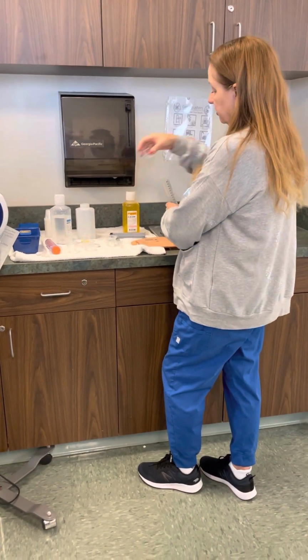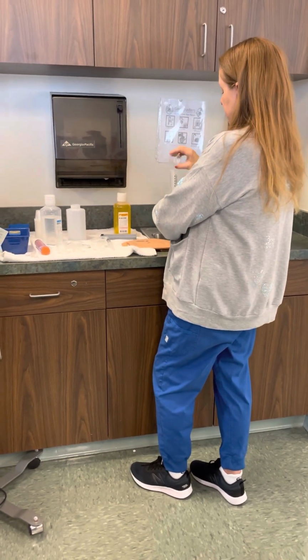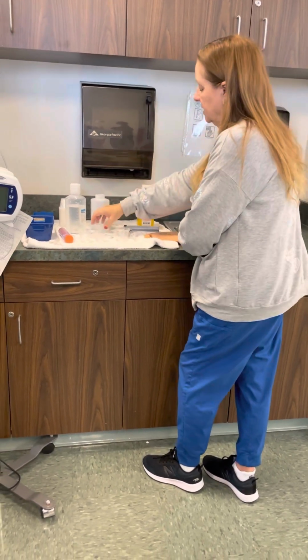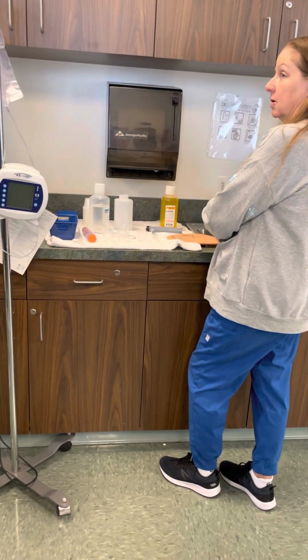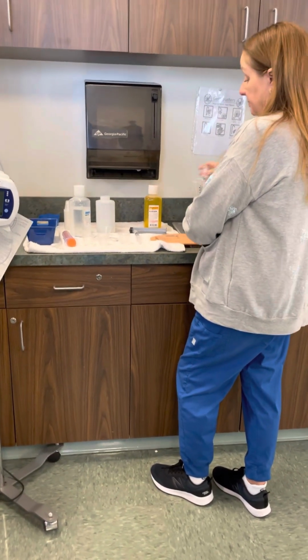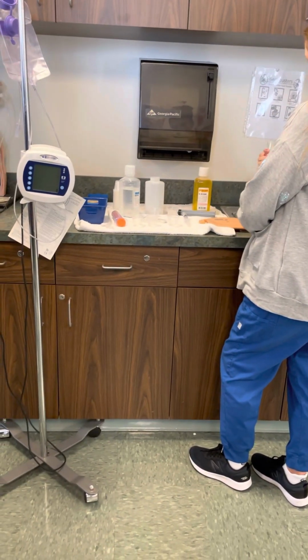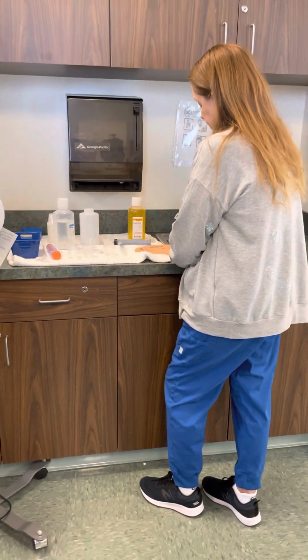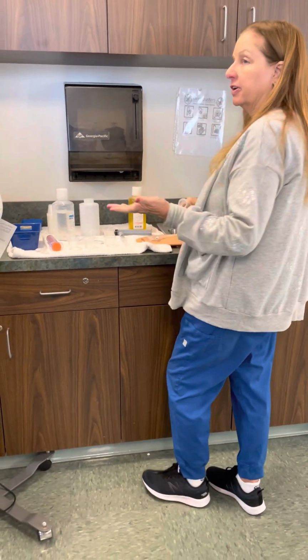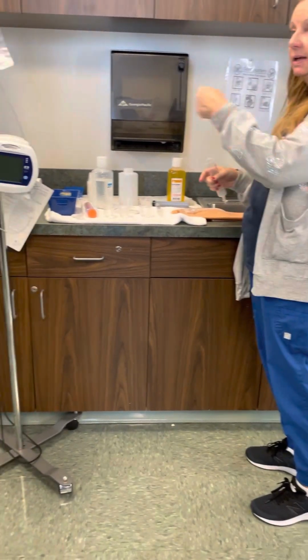See how it's just draining through? And then I'm going to get my second medication, and then I'm going to finish off with my last flush of water. And now I'm done. I'll close this off. And usually I'll wait about 30 to 60 minutes depending on the order, and I'll reconnect their feeding.